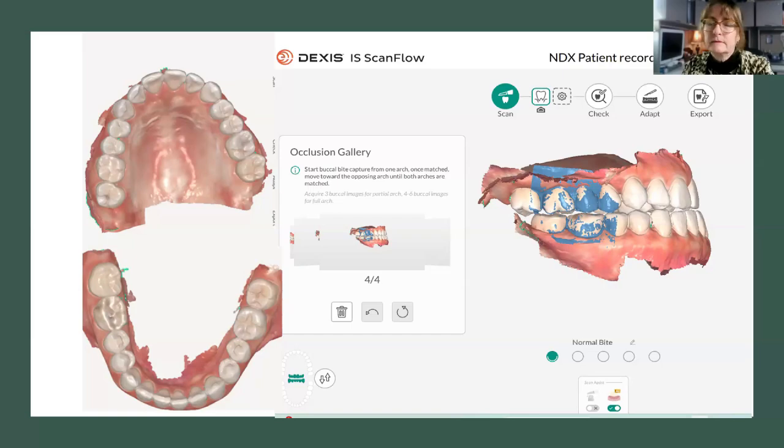Yes. When I'm on the maxillary arch, my second scan after that occlusal table would be my buccal. And clinically, here's the reason why. That's when the patient's lips will get tired and they start to tighten up. So I like to get that hard area out of the way. And then I would do my lingual data, and then I would start to collect my palate.